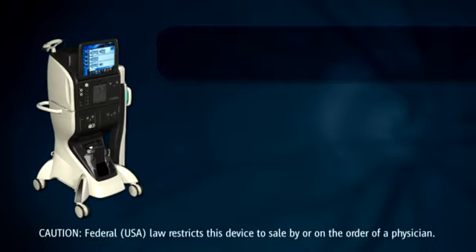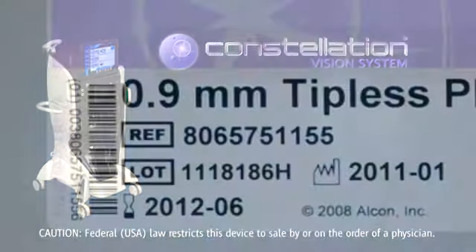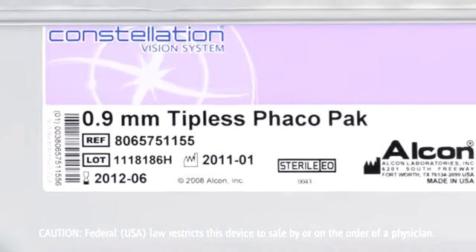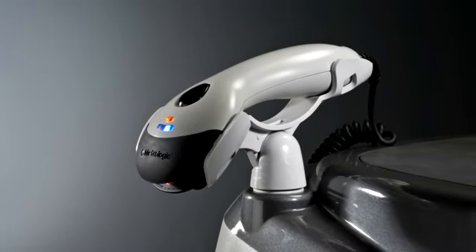In this video, we demonstrate the anterior vitrectomy setup procedure. Each Alcon product pack has a barcode located on the labeling. Before opening the anterior vitrectomy pack, scan the barcodes on the barcode scanner.